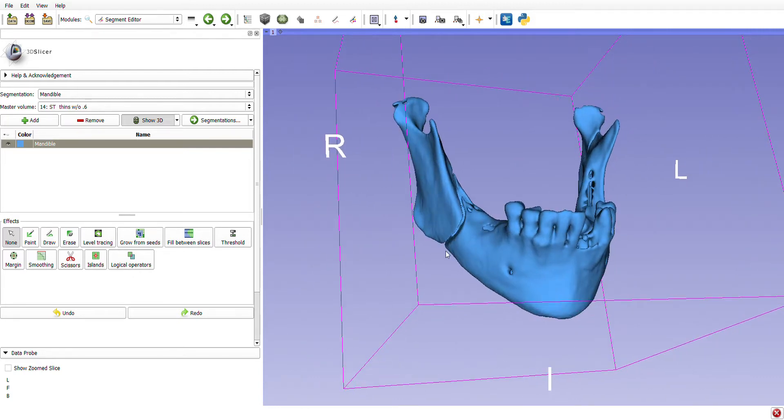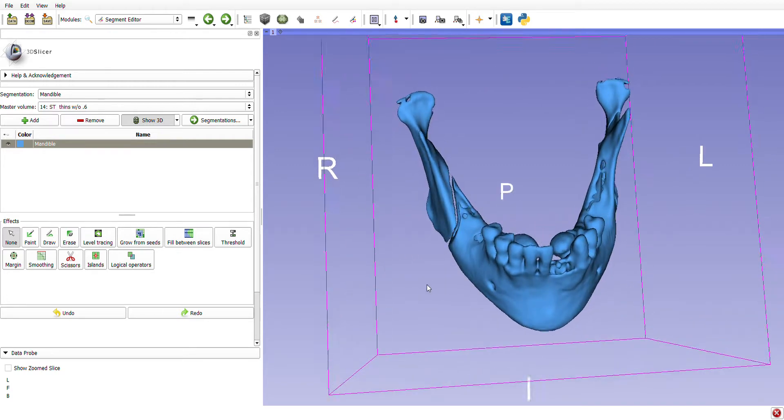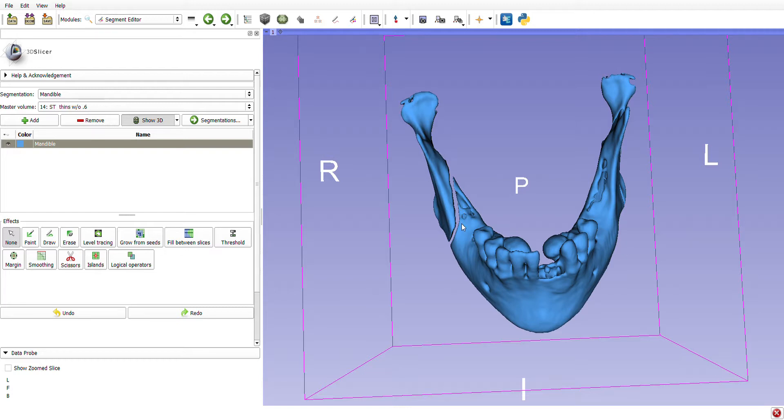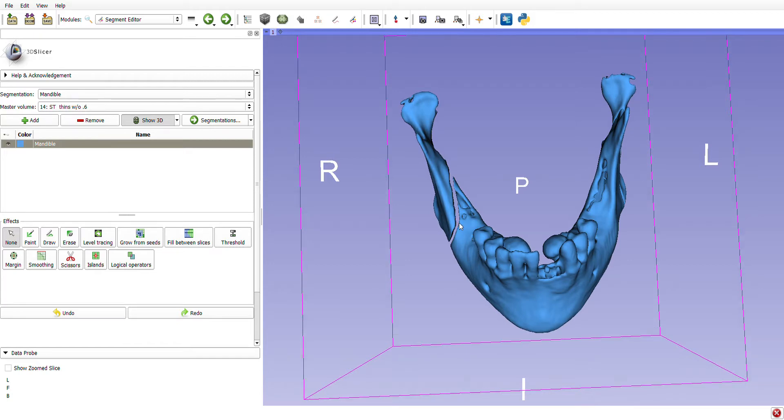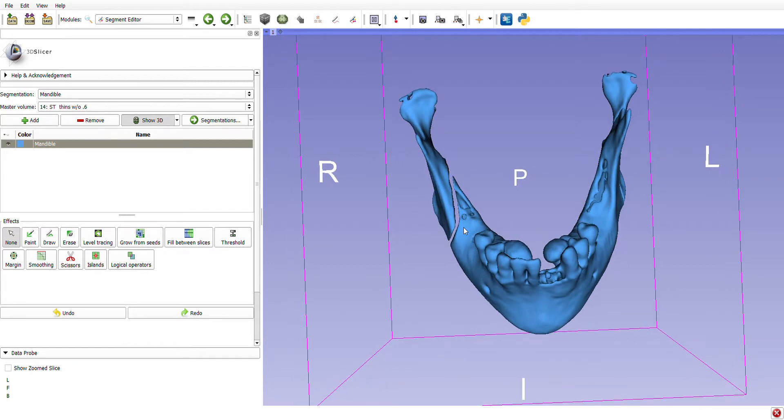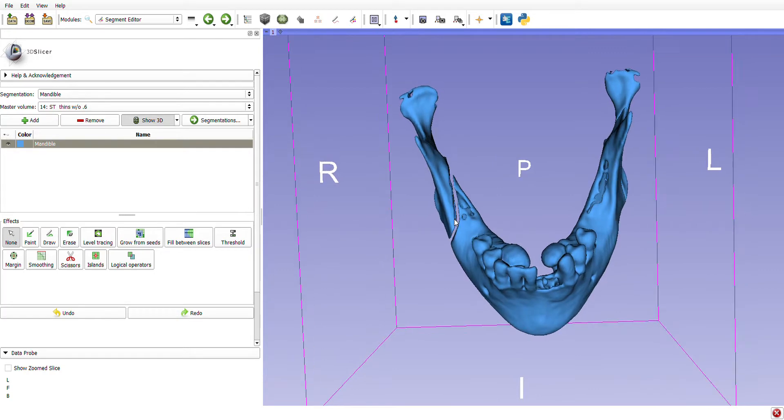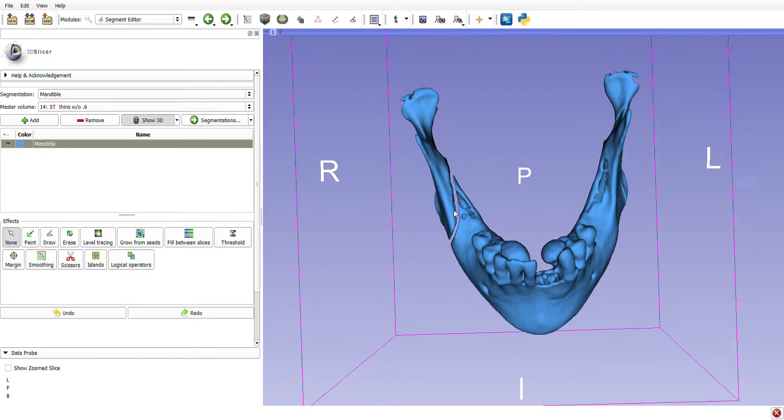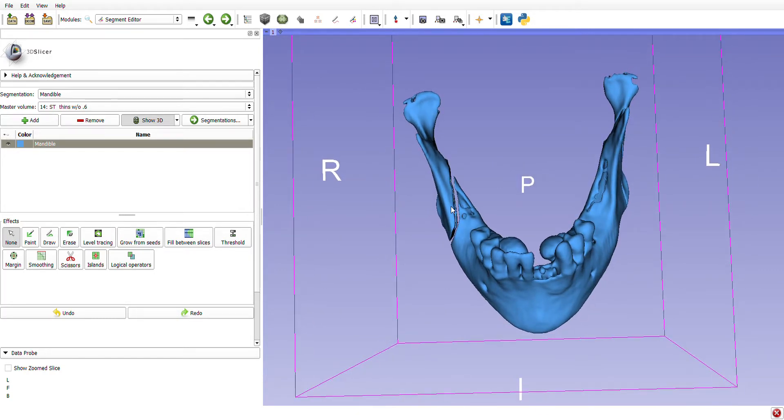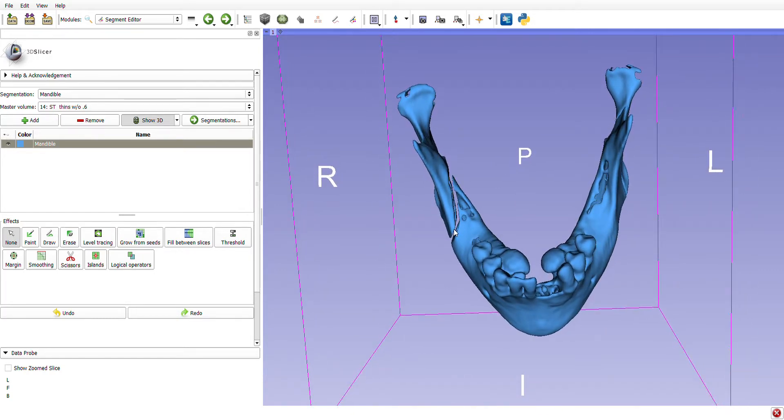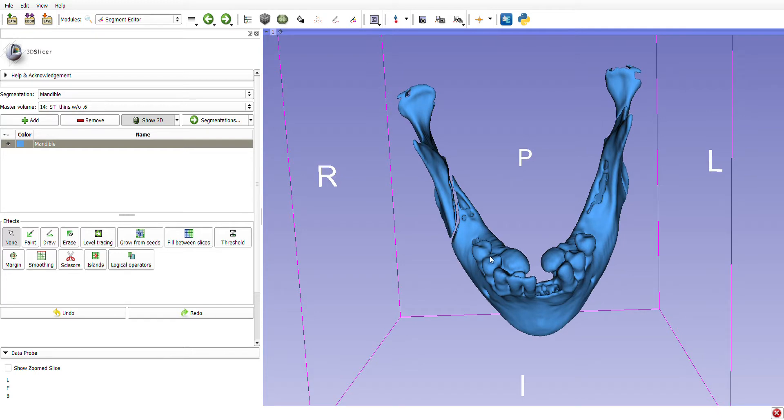and all the way through the inferior border, then pliers go into this little gap and slowly spread it open. These spreaders ratchet up just a little bit at a time and you hear a cracking and a splitting. Typically, if the osteotomies are done right, it splits around that inferior alveolar nerve canal in a fairly reliable and predictable manner.